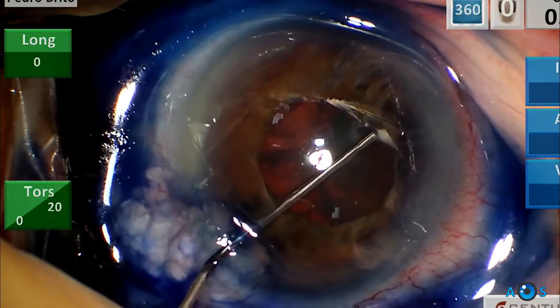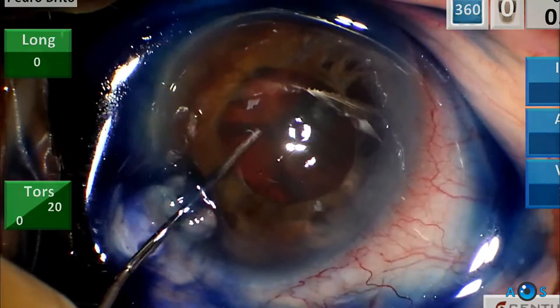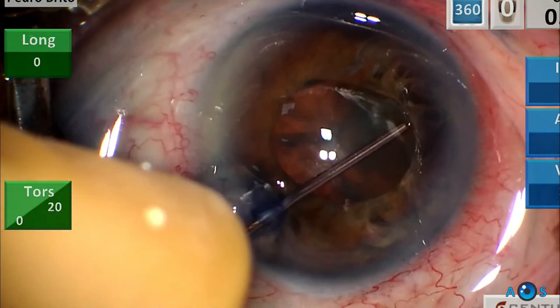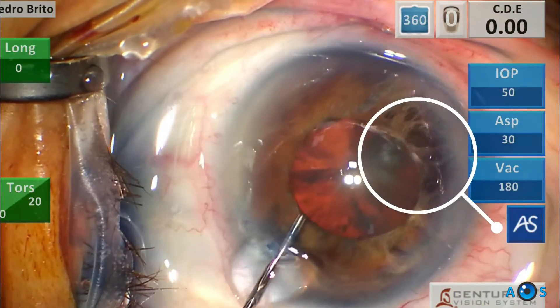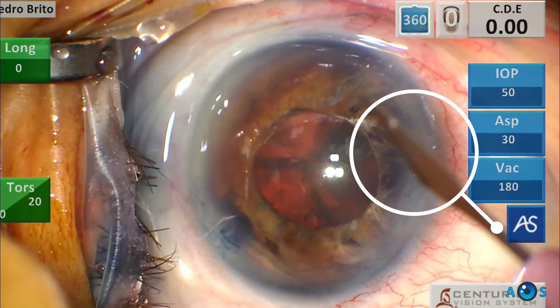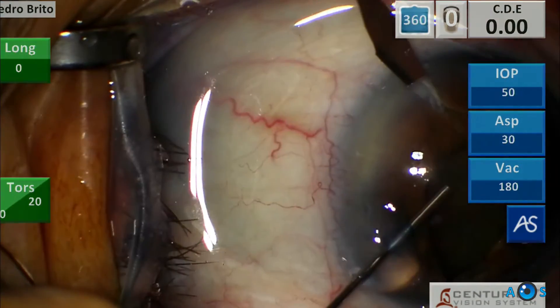After tinting the capsule with Trypan Blue, a cohesive OVD is used to expand the pupil, carefully aiming to inject underneath it in order to release the posterior synechiae. There is a clear and significant extension of the atrophic iris, which indicates that the small pupillary area will not be maintained during surgery.